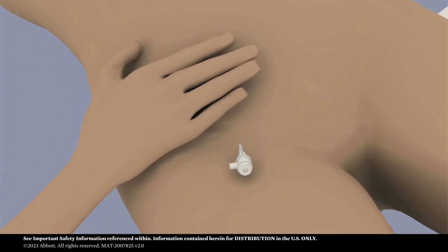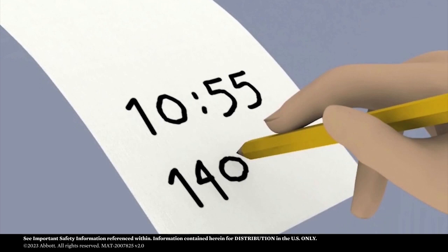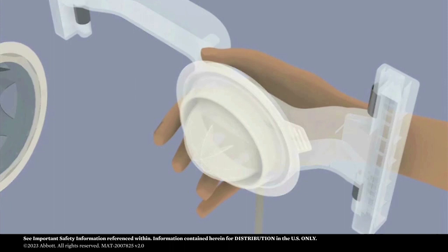Carefully examine the puncture site area for any pre-existing hematomas. Note the patient's current blood pressure to determine initial supersystolic pressure. Also check pedal pulse to determine what is normal for the patient. Remove the protective lid from the sterile surface of the dome and maintain sterility of the dome as long as possible.